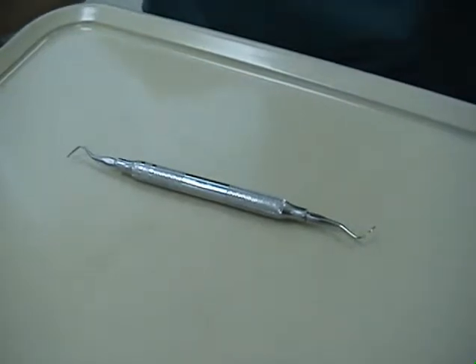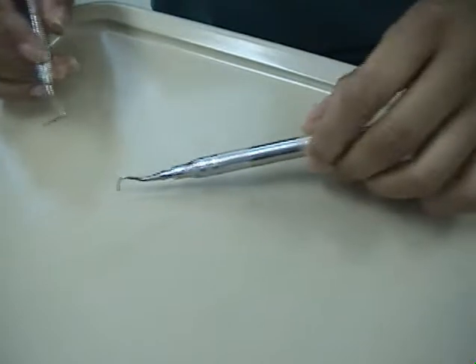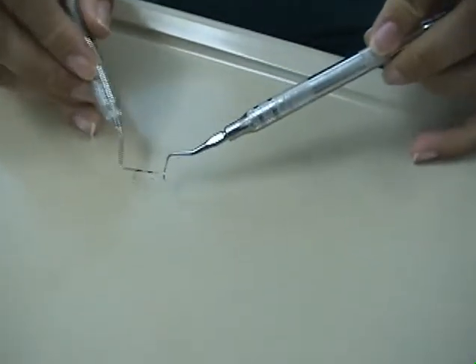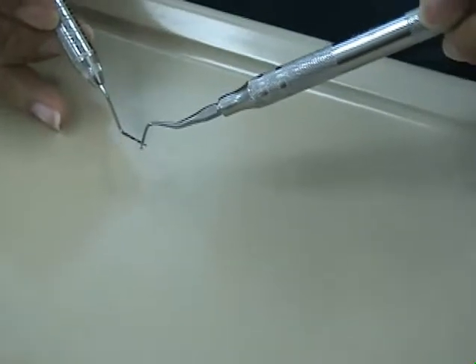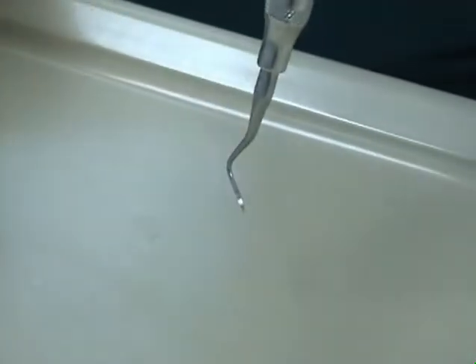Here's the universal curette. It has a rounded back, two cutting edges per working end, and a rounded toe. The face of the curette is perpendicular to the lower shank so that the cutting edges are level with one another.